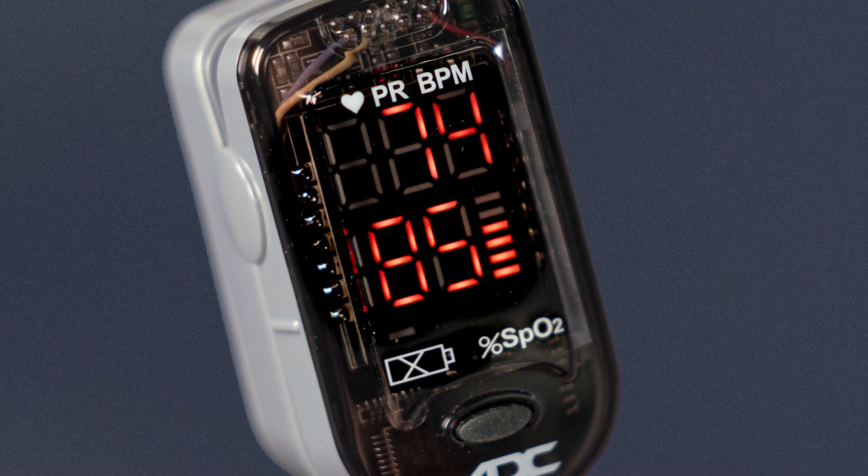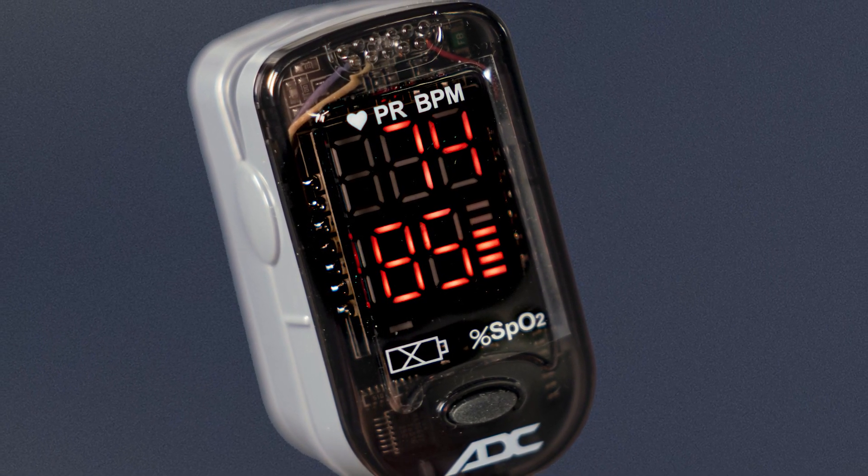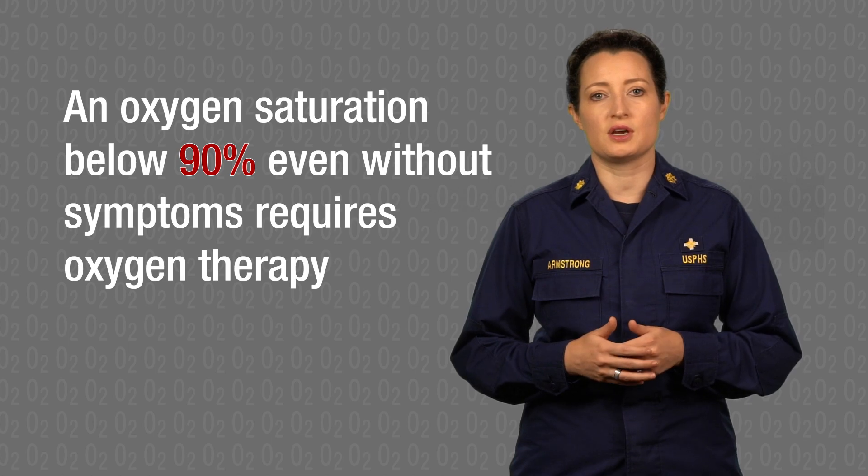The pulse oximeter shows that our patient has an oxygen saturation of 85%. An oxygen saturation below 90%, even in a patient without symptoms, requires oxygen therapy.